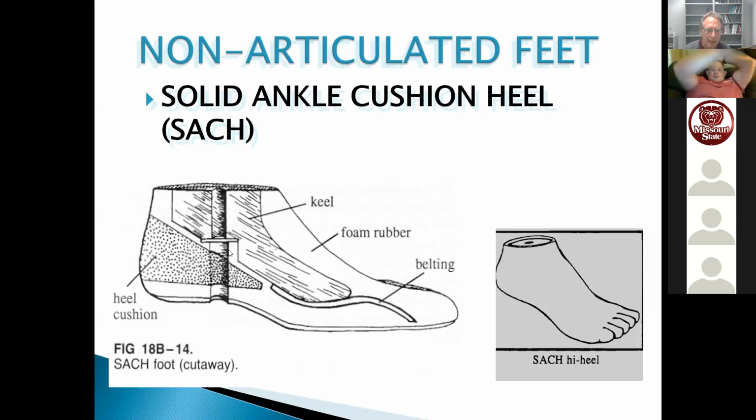One more thing, so here, if you look at this diagram, you can see that there's this softer foam that makes up the heel, and then there is something called a keel. And I've got another example here that I want to show you.